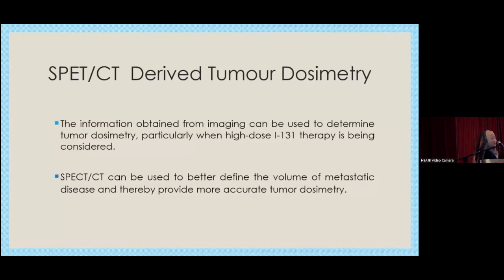So last but not least, there is a role of SPECT-CT in deriving tumor dosimetry. In HKL, we don't have the opportunity to do so. Probably IKN has the chance to do it. But from there, the information obtained from imaging can be used to determine tumor dosimetry, particularly when high-dose iodine therapy is being considered. And SPECT-CT can be used to better define the volume of metastatic disease and thereby provide more accurate tumor dosimetry.